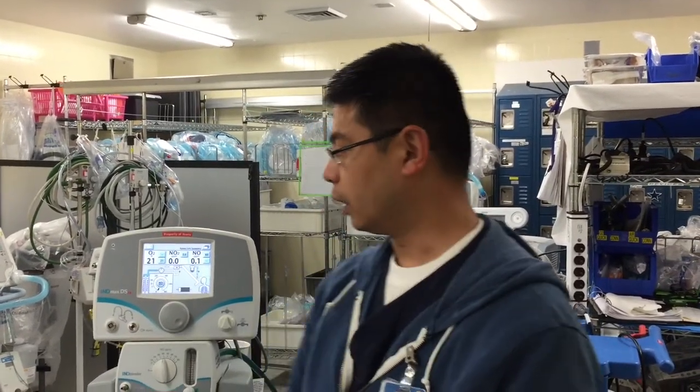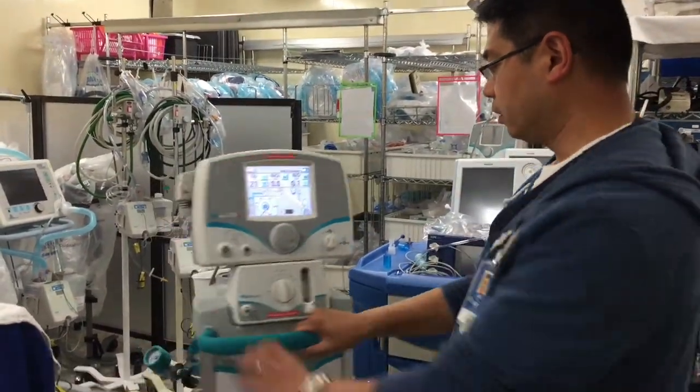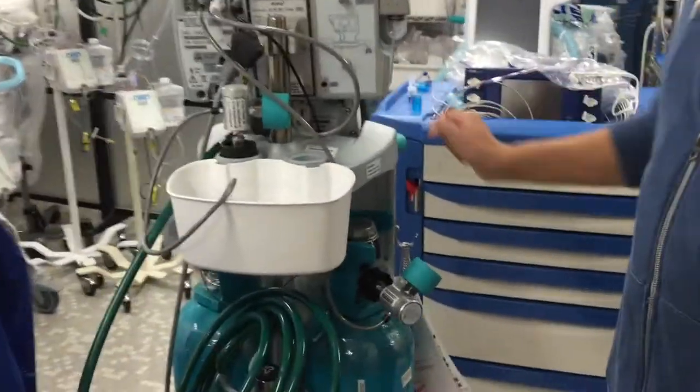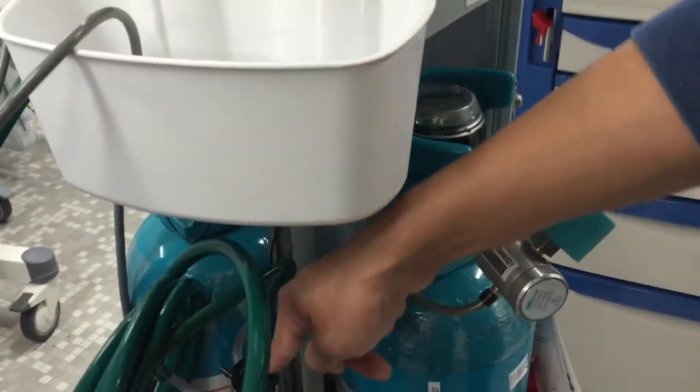Hi everyone, today we're going to be talking about how to set up your nitric oxide machine. This is your nitric oxide machine in the back. It has two nitric oxide tanks and an oxygen tank.